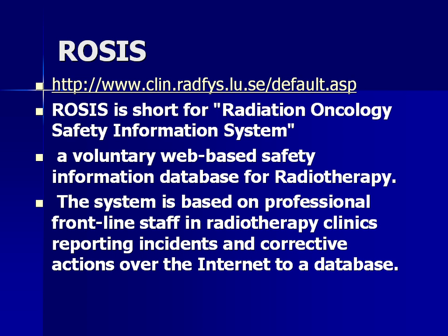Yeah. There's actually a website in Europe called ROSIS, short for Radiation Oncology Safety Information System, and people can voluntarily submit their safety information to this website. In this country, we have a website at the FDA, so if a QA incident happens, we would report it to the FDA website.